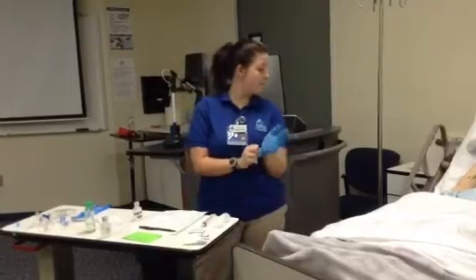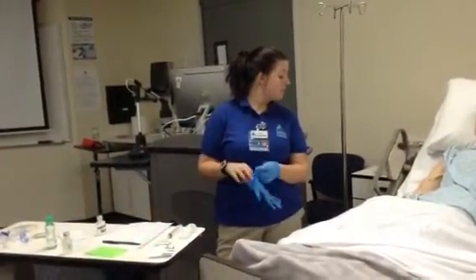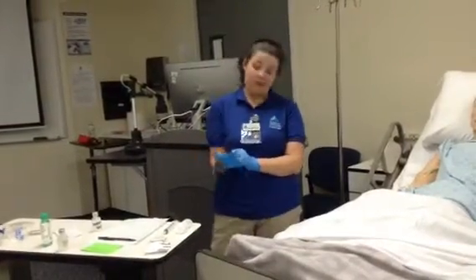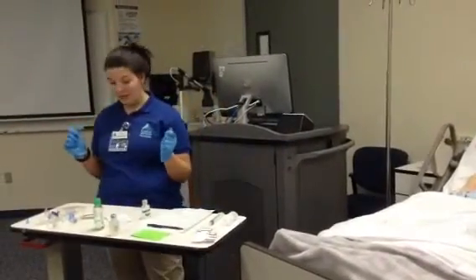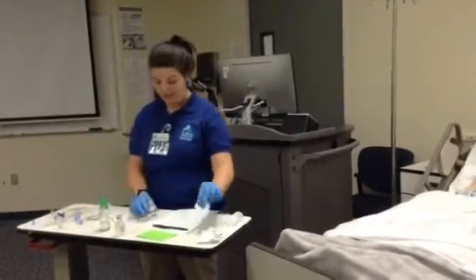medication. Okay, I'm going to go ahead and look at that IV site though. I don't see any phlebitis or infiltration, no redness, inflammation, cold, wet, leaking, anything like that. Okay, now what I'm going to do is clean the top of my vancomycin.